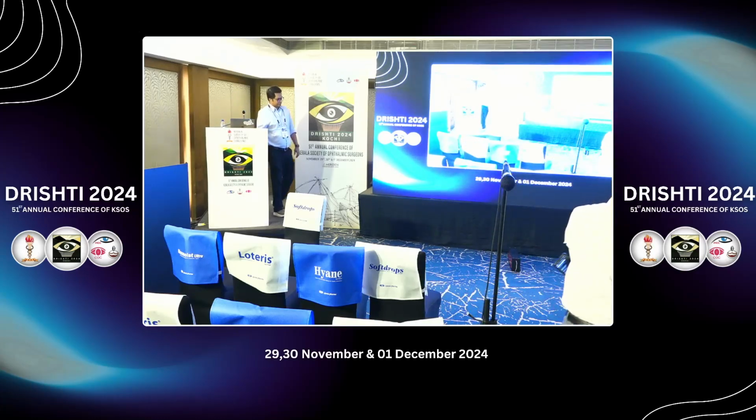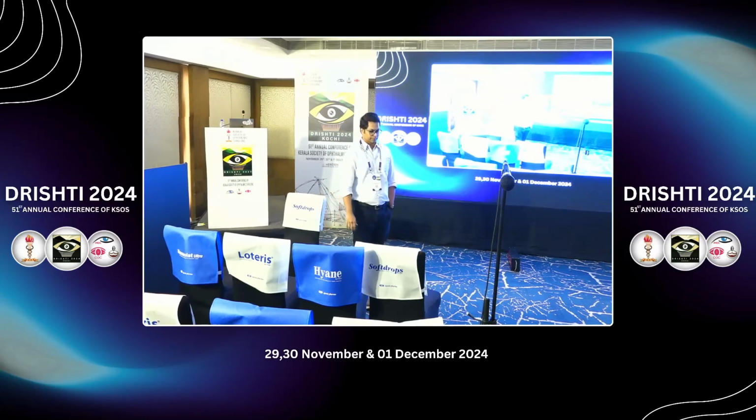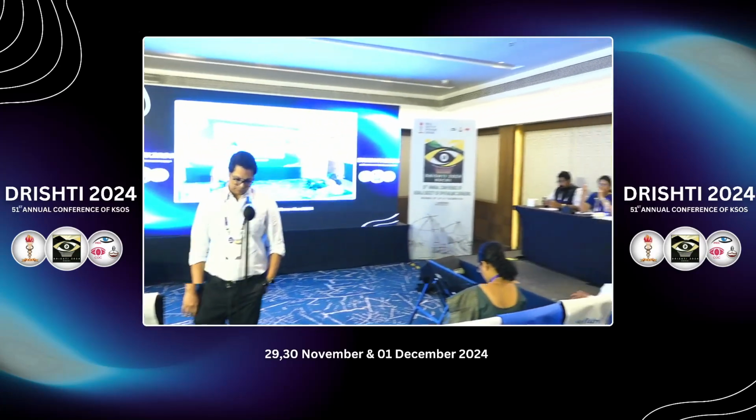So this is from a glaucoma consultant perspective. As far as cataract people are concerned, the importance is this: if you're operating under low phaco parameters, the shatter of the pieces will be less and the corneal clarity will be more. And more importantly, in certain special situations like IFIS or posterior polar cataract or in high myopes where the scleral rigidity is low, you will have to enter the phaco probe with low infusion pressure because you want a stable chamber. So proportionately, you will have to reduce the vacuum and aspiration rate so that there is no sudden shallowing or collapse of the anterior chamber. In those situations, the chamber will be stable, so you will be able to do the phaco safely.